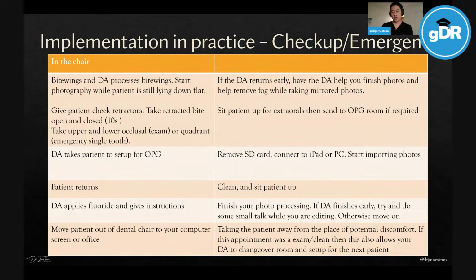I like to minimize patient movement. So when the patient's lying down and the DA is taking the bite wings, I'm going to get the patient to hold retracted and I'm taking my set of photos. Saves me a bit of time getting them to sit up. Then when they sit up, about to take the OPG, before the OPG, I will get them to take the extra oral photos, then send them to OPG. That's my photos done. So we're minimizing extra travel time, seeing the chair up, seeing the patient, seeing the chair down.